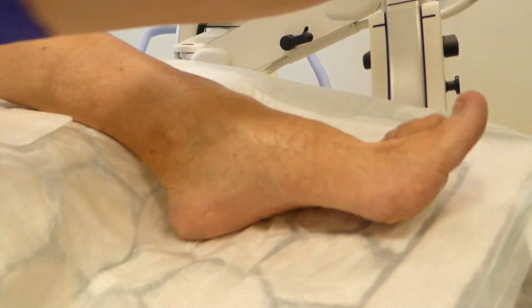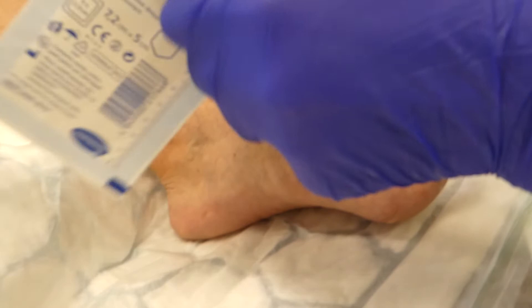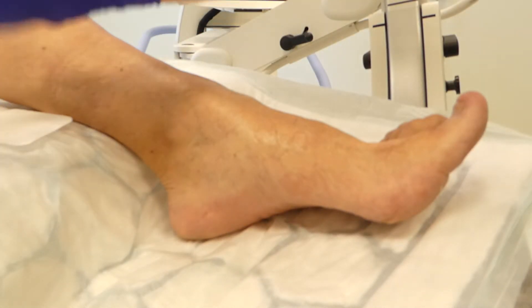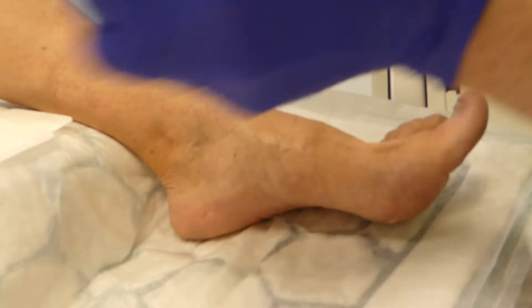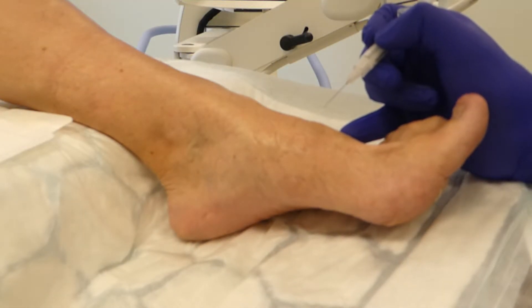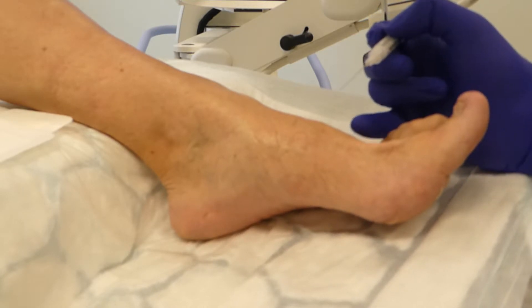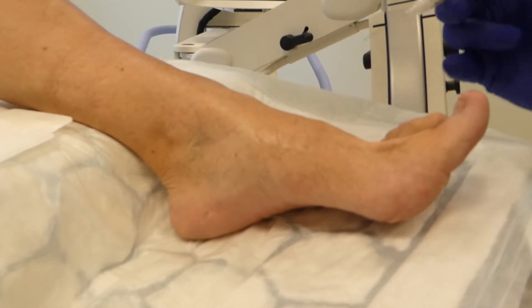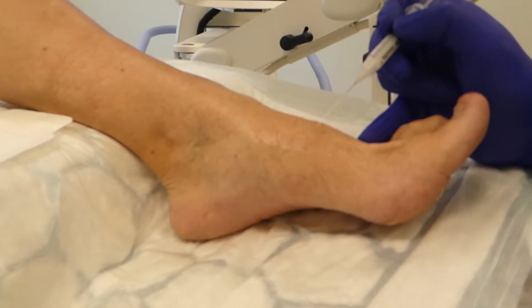If you've seen any of my other videos, you know that I'm not a professional cameraman and certainly have the best face to stay behind the screen. So there's our 27 gauge needle, and I'm going to concentrate on the foot. We're going to do just a little check X-ray first to see if we're in the right grid square.